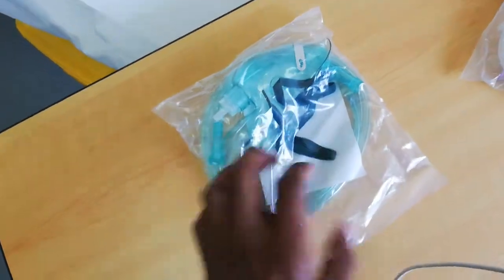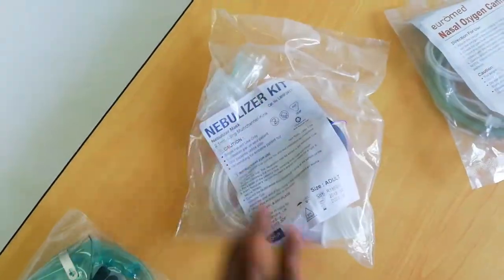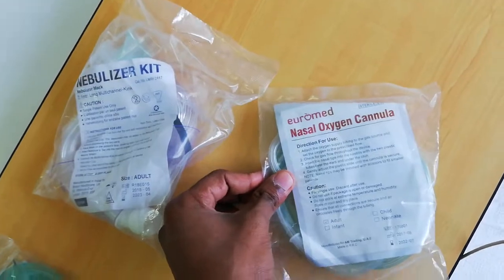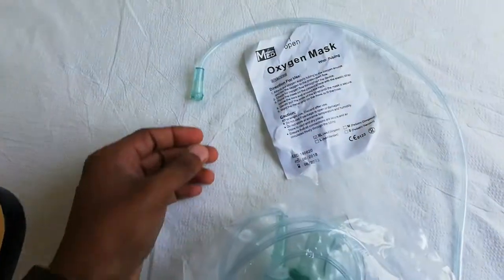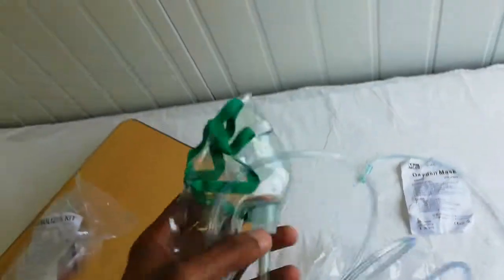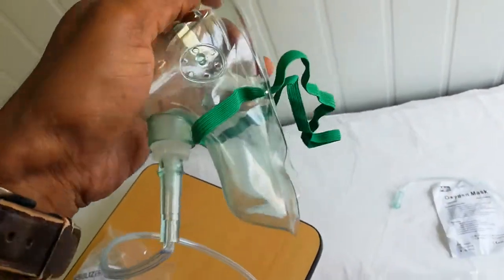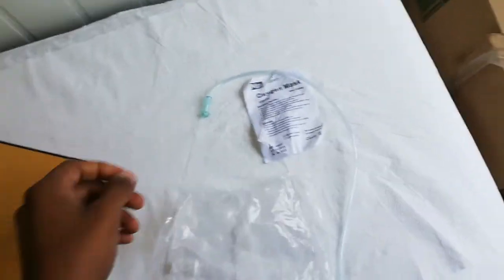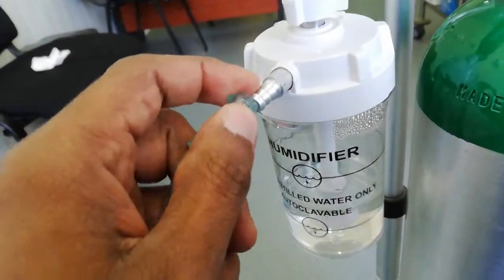This is the oxygen mask. This is a nebulizer kit — we attach the nebulizer kit here. This is a nasal oxygen cannula. We put the oxygen mask on and secure it with a cover and rubber band. This is the tip, and we connect the oxygen to the humidifier via this pipe.